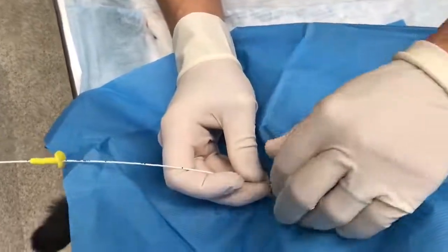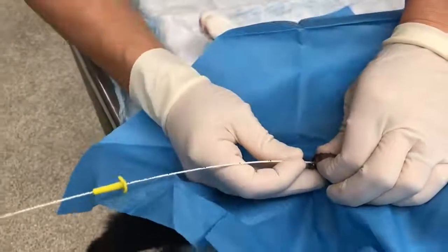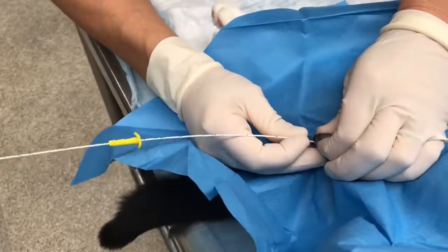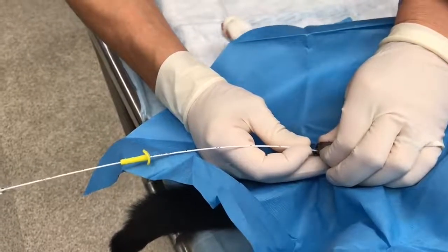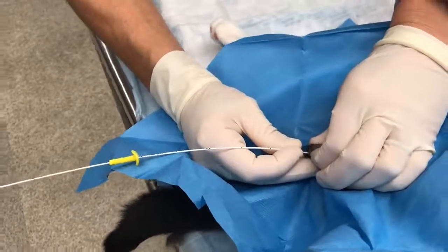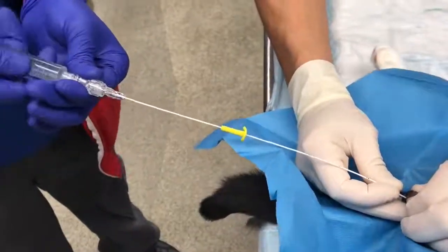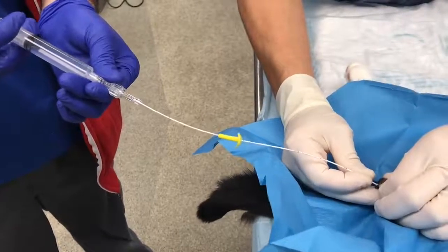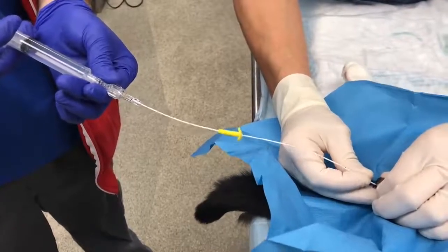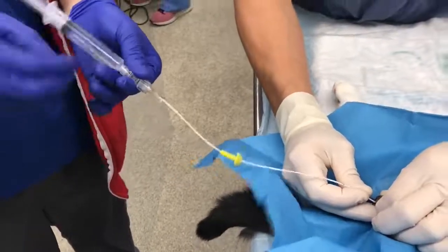Once the catheter is in the urethra, you will want to pull the penis within the prepuce dorsally and caudally to straighten the urethra. If the catheter doesn't advance easily, attach a sterile flush to the catheter and perform retrograde urohydropropulsion to push the obstruction into the bladder. You may move the catheter back and forth during this process.